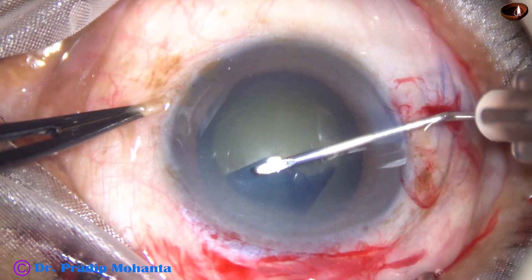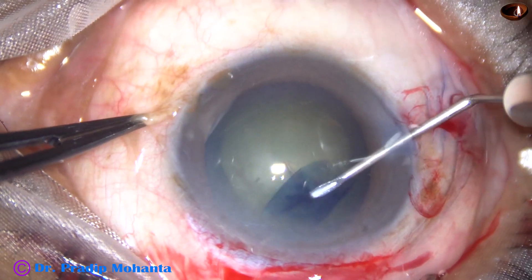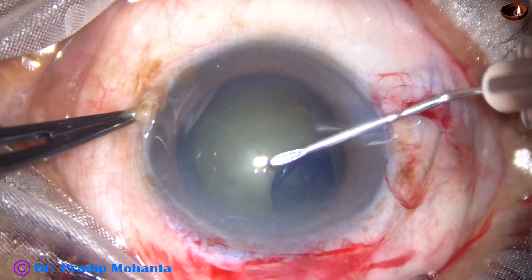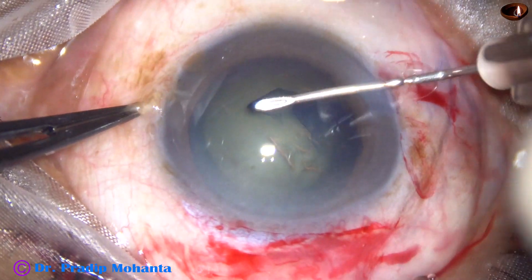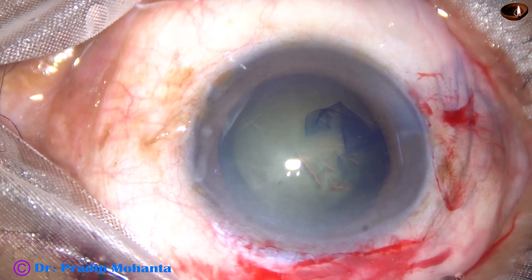For 180 degrees, you push it. For the wrist, another 180 degrees, you pull it. And this is how you do capsulorhexis.